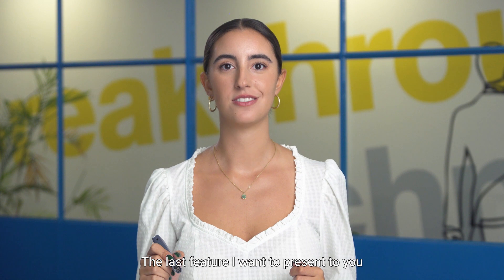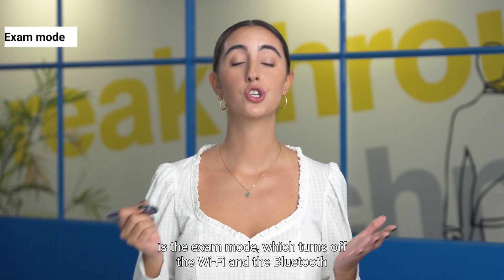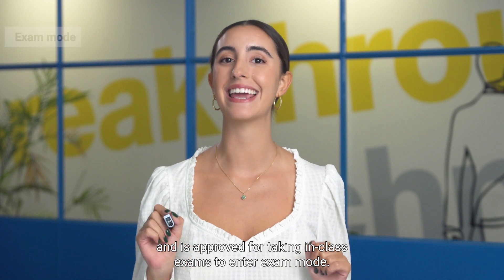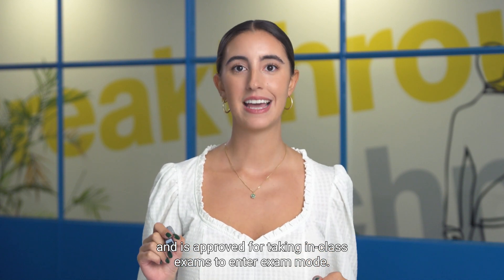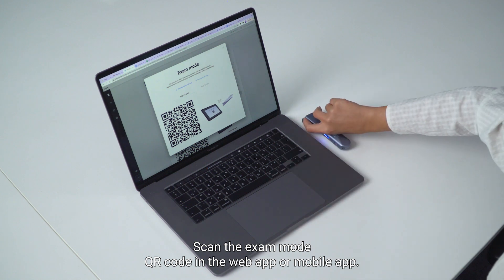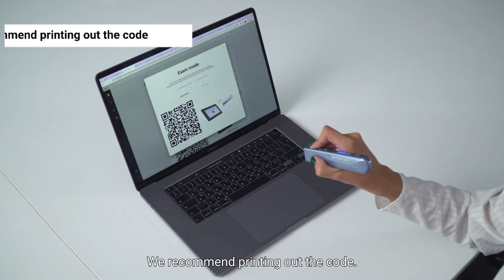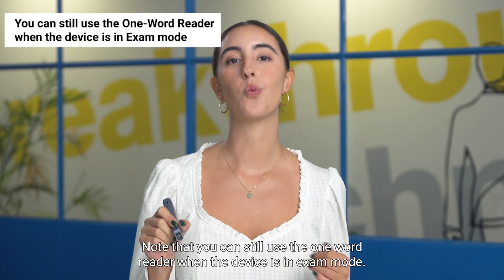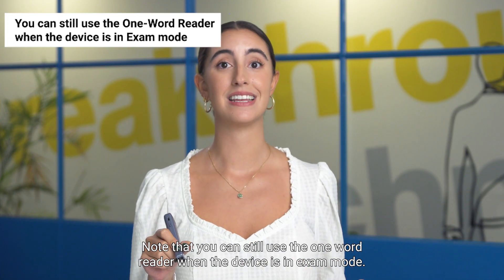The last feature I want to present to you is the exam mode, which turns off the Wi-Fi and the Bluetooth and is approved for taking in-class exams. To enter exam mode, scan the exam mode QR code in the web app or mobile app. We recommend printing out the code. Note that you can still use the one word reader when the device is in exam mode.